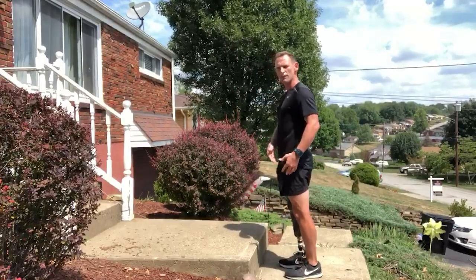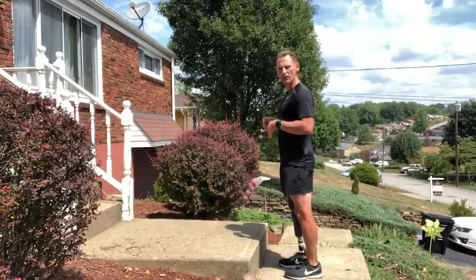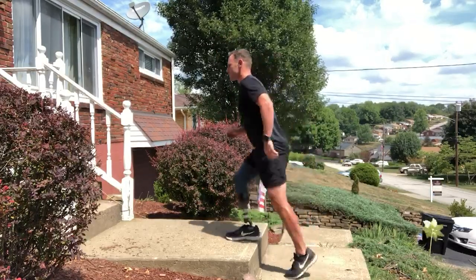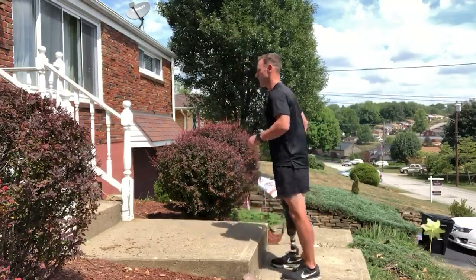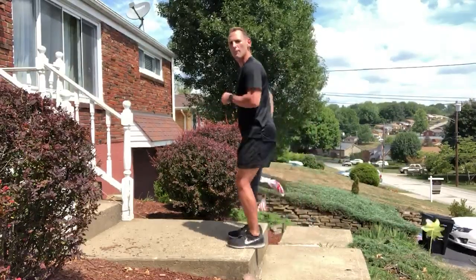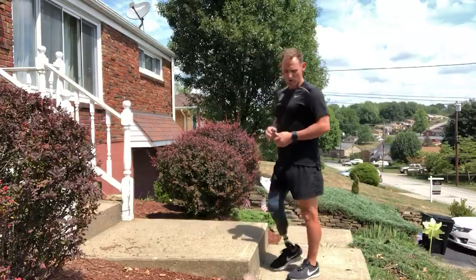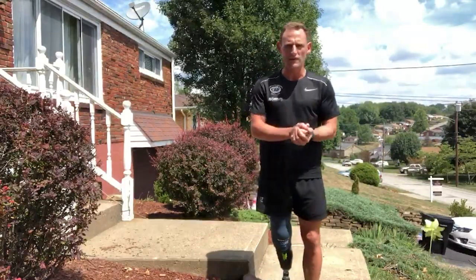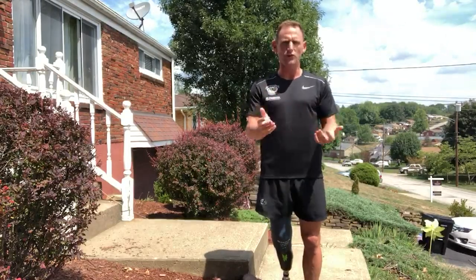Now we're going to use the other foot, so we can use both sides, and we're going to continue to go. One step up, one step down. One step up, one step down. All right, after you do that and you're comfortable with it, you can do a set of 20 seconds or 30 seconds or multiple sets.